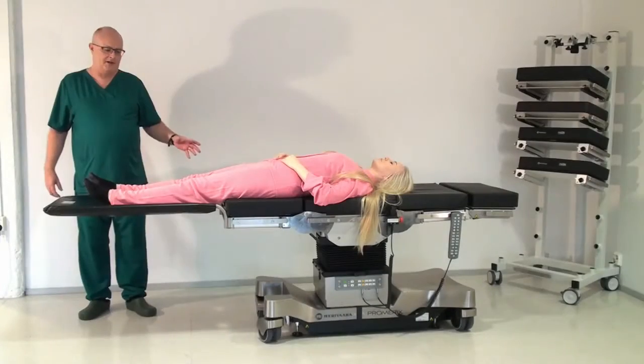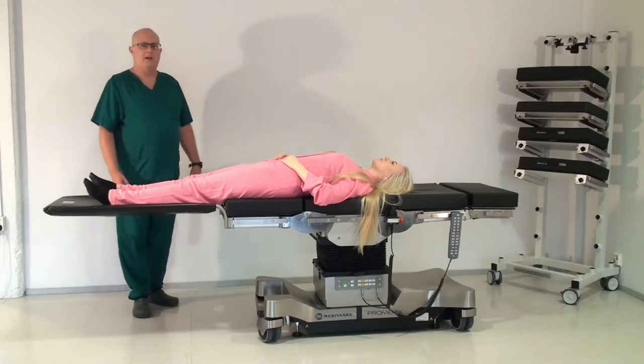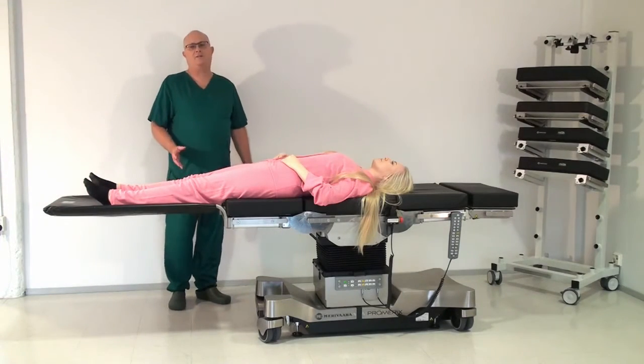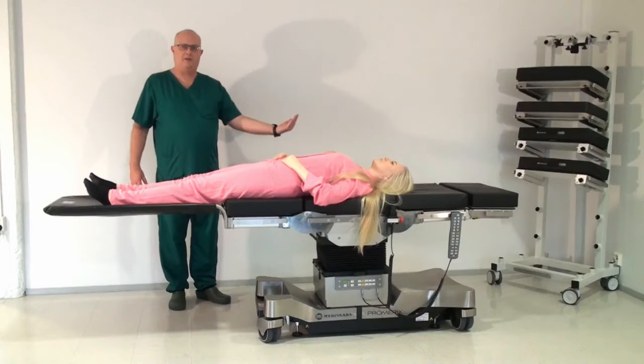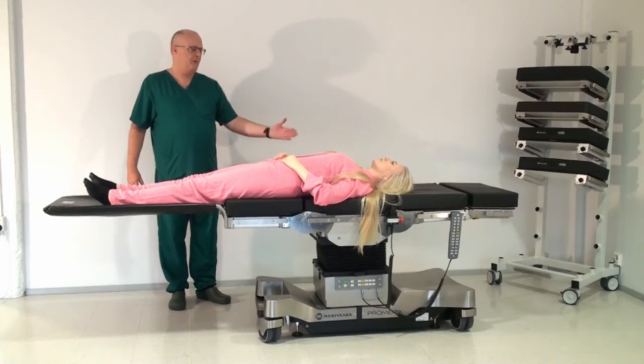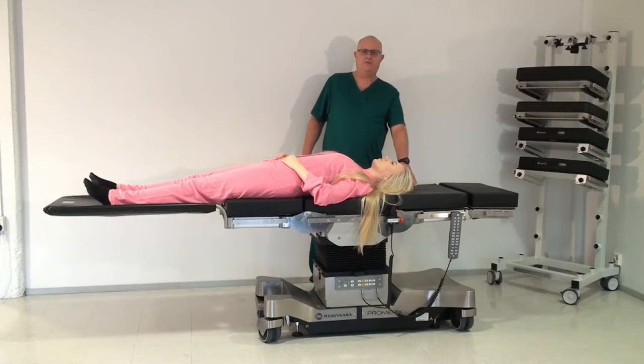We have someone on the table using the lightweight leg section, which you've just seen put into place. And the idea, from the point of view of an anaesthetist with the laryngeal mask airway, is they need access to the head at all times. So the table's normally on a 30-degree tilt, so the patient's sitting up and they want the head on the head section. You can see now that the table is far too long.